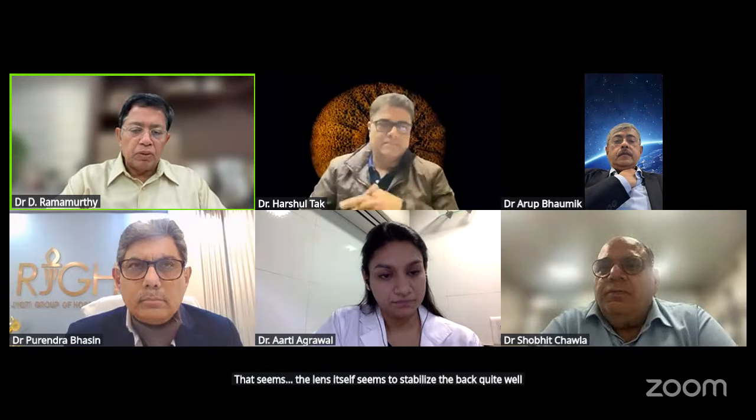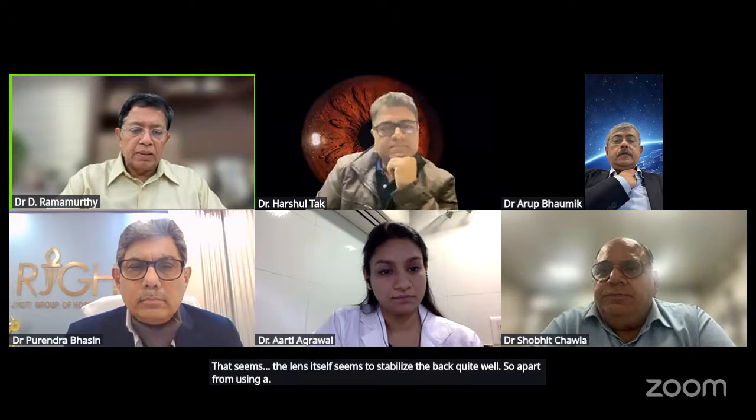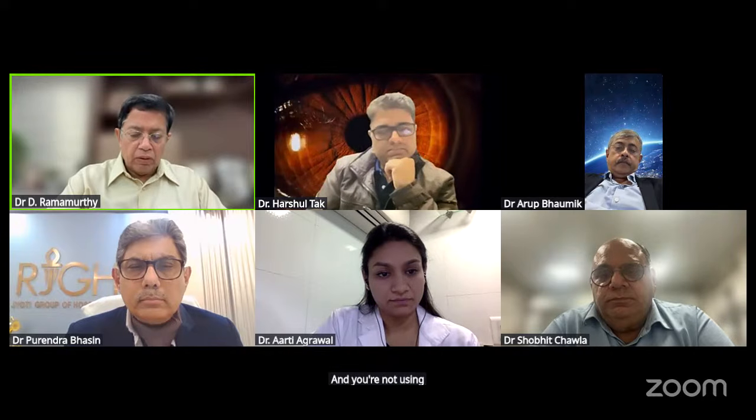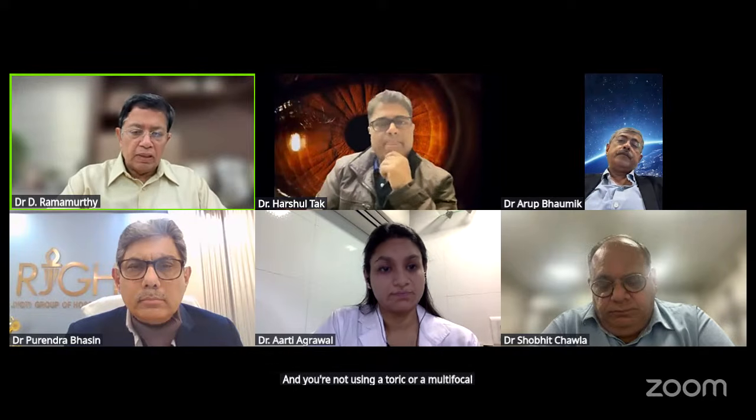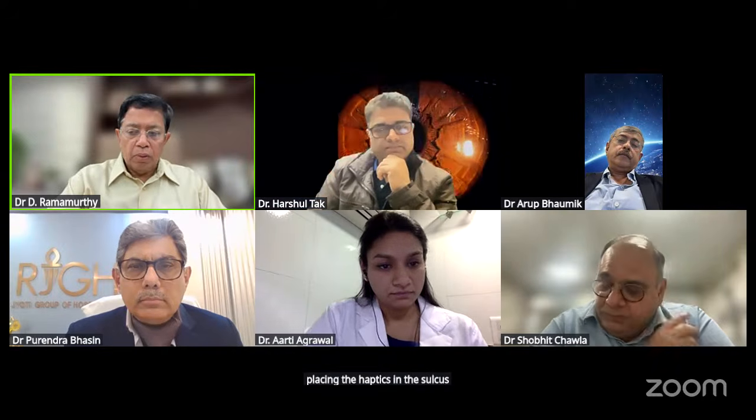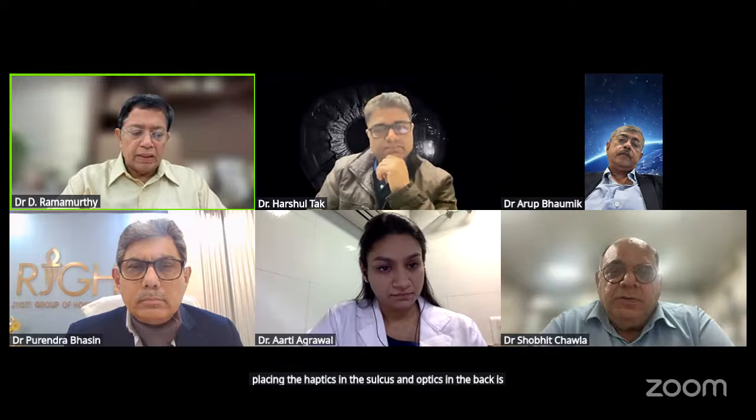So apart from using a CTR or a CTS to stabilize, especially if you just use a CTR and you want further support, and you are not using a toric or a multifocal lens, using a three-piece lens and placing the haptics in the sulcus and optics in the bag is, of course, a great idea.